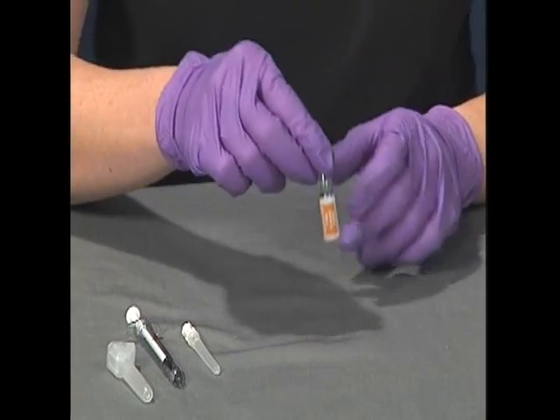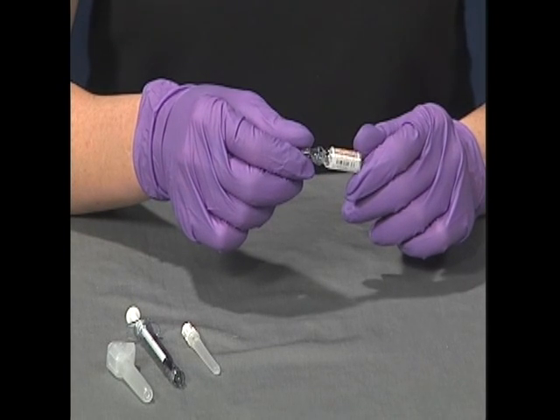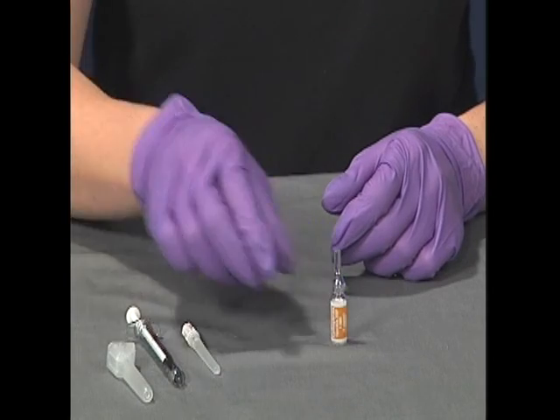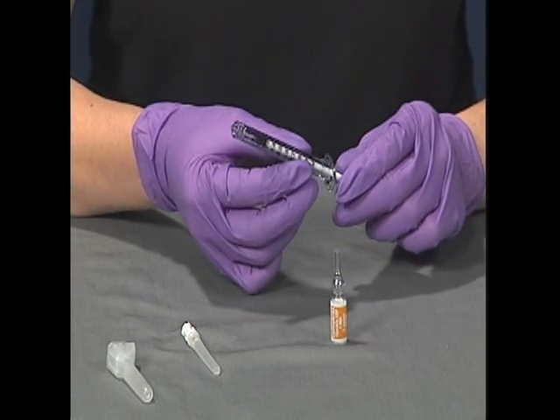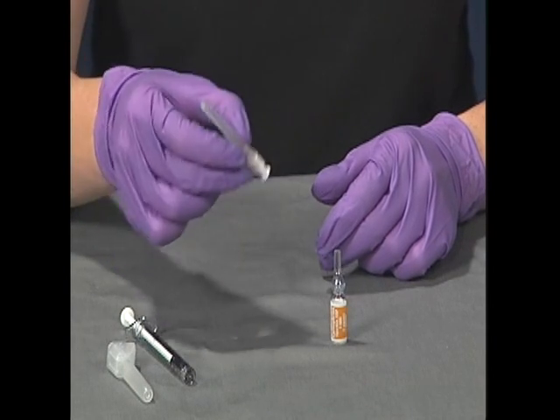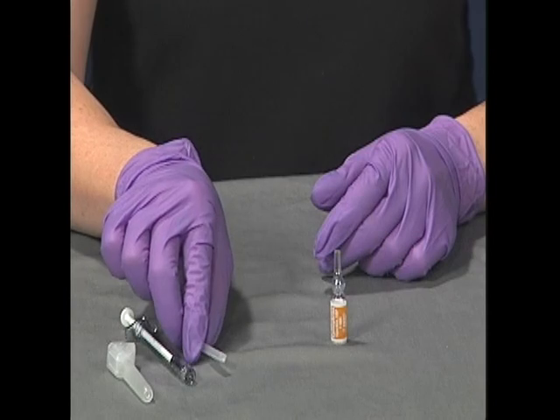Inspect the medication to verify the right medication, the right dose, the right expiration date, the right route, and the right patient. Select an appropriate size syringe for the medication to be delivered. Select the filter needle of appropriate size and length to withdraw the medication and attach it to the syringe.